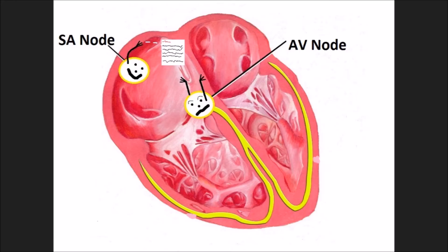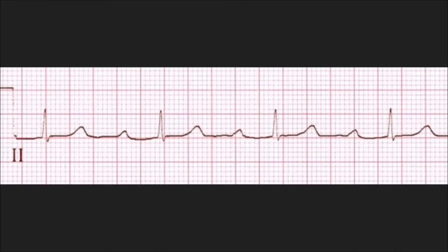Let's take a look at this ECG strip. You will see in front of you a first degree AV block, and you can tell that it is because the PR interval is far too great to be normal — it is greater than 0.20 seconds.